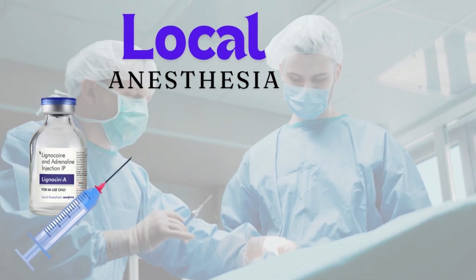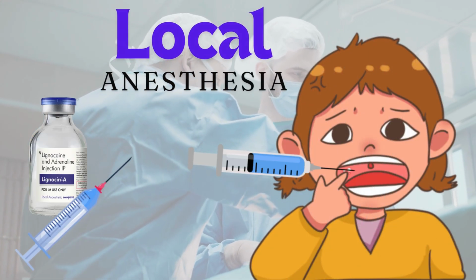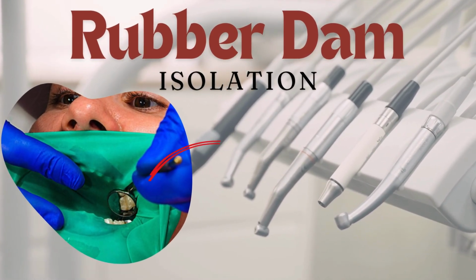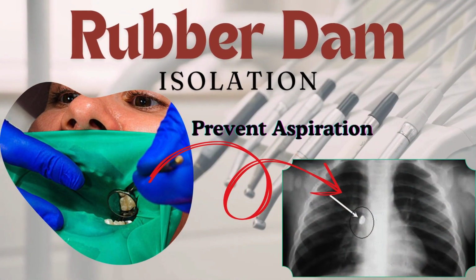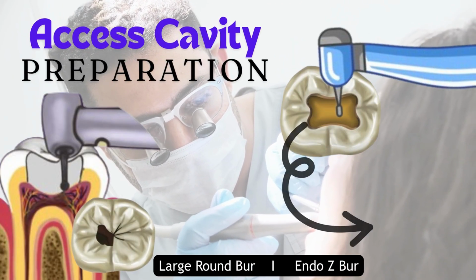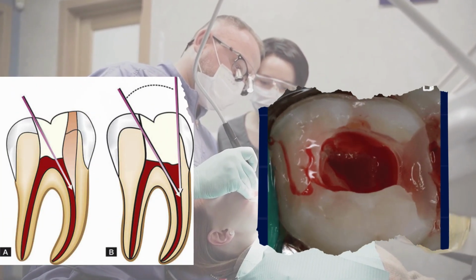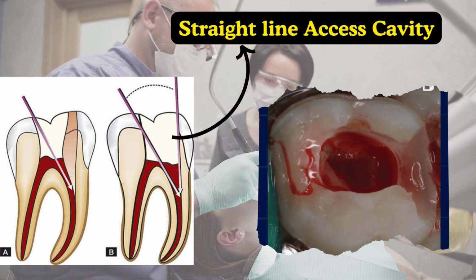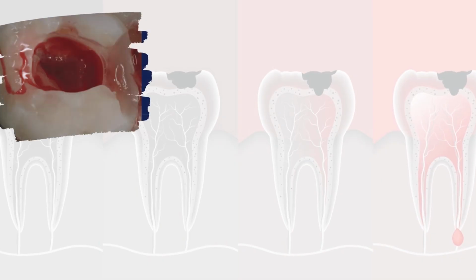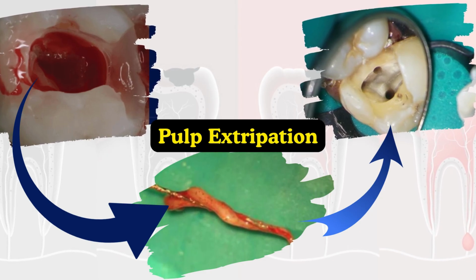Achieving adequate local anesthesia is paramount for a comfortable and successful procedure. Rubber dam isolation is mandatory to maintain a sterile working field and prevent aspiration. Access cavity preparation is carried out using a sterile round bur and safe-end bur. An access cavity is prepared to gain a straight line access to all the root canals. The outline form will vary depending on the tooth being treated. Once access is achieved, the coronal pulp tissue is carefully extirpated using a barbed broach.